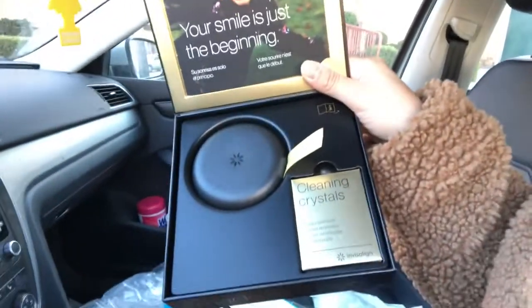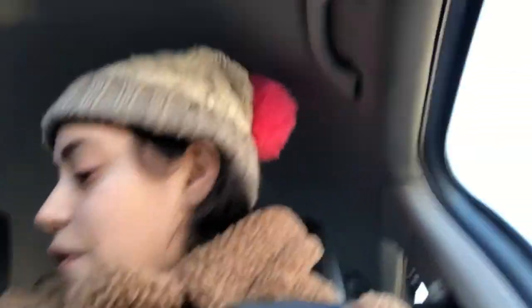I just got out of there — I got my 12 trays. They gave me a case, and inside there's something to clean your trays with. It feels more official now. Yes, it's official — I got my little case so I'm not losing my Invisalign trays. I have to have them on for about 20 to 22 hours a day. Take them out when eating, and you can only drink cold or room temperature water with them in.